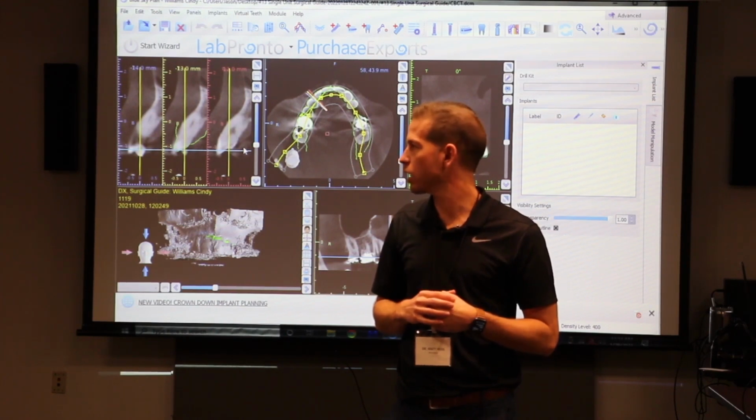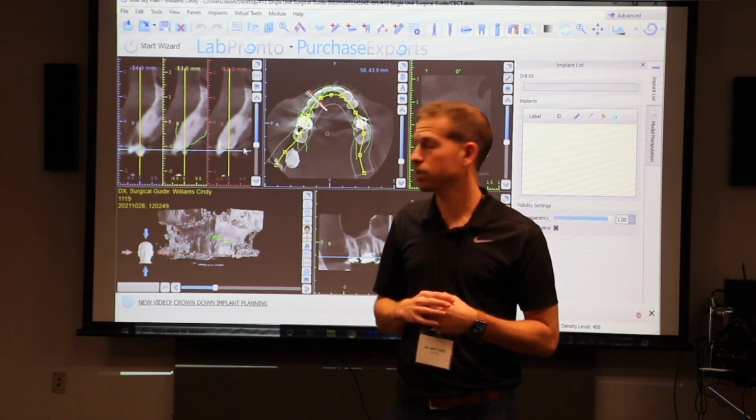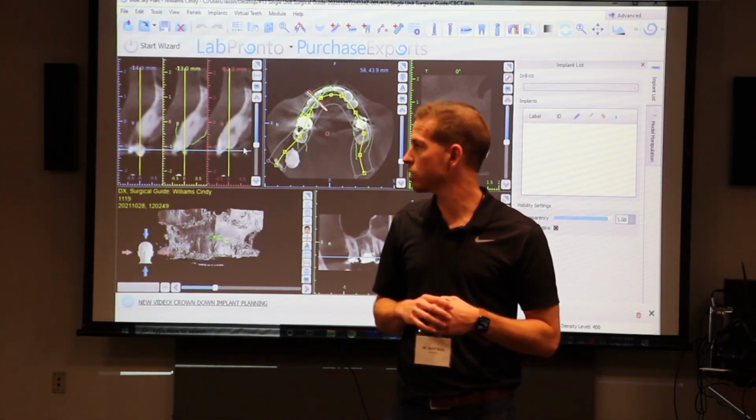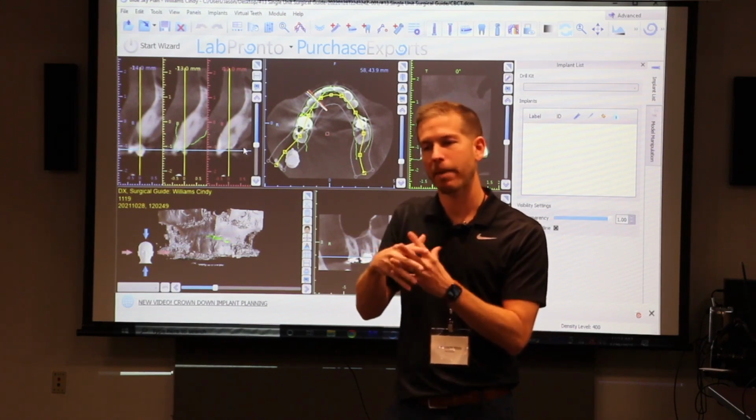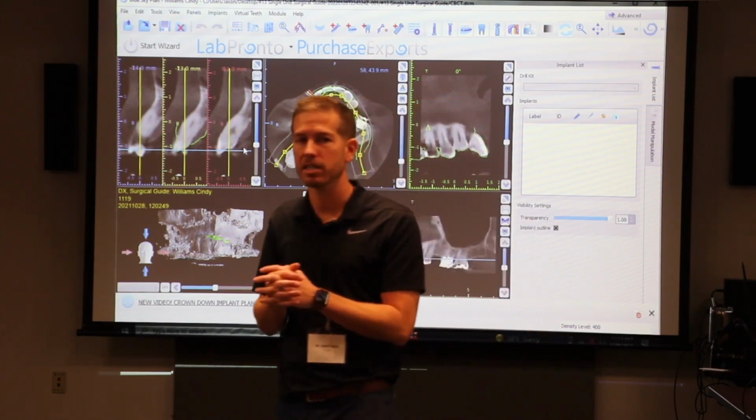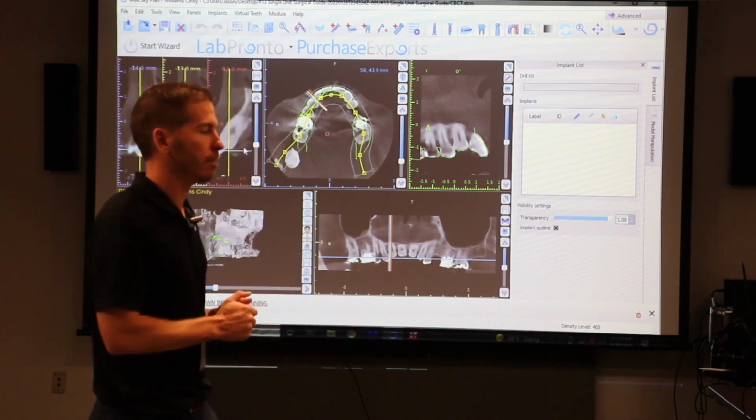They'll stitch correctly. Yes. Like I haven't run into that yet. You know it can happen, but the vast majority of cases it's pretty good. And the software algorithms, that best fit matching does work really good, so you just trust it. And you verify it first.